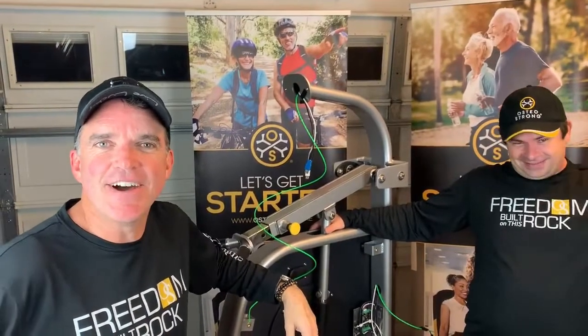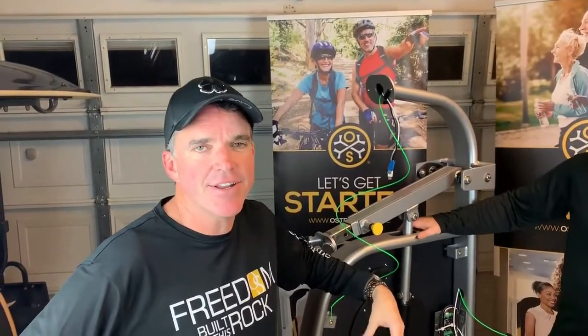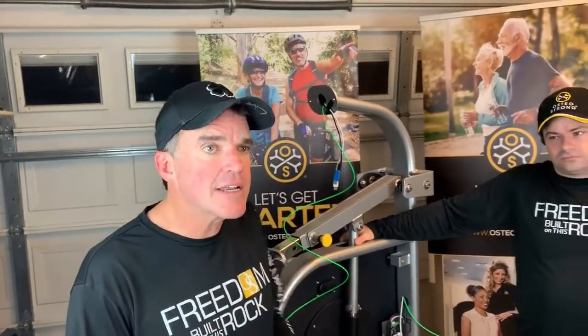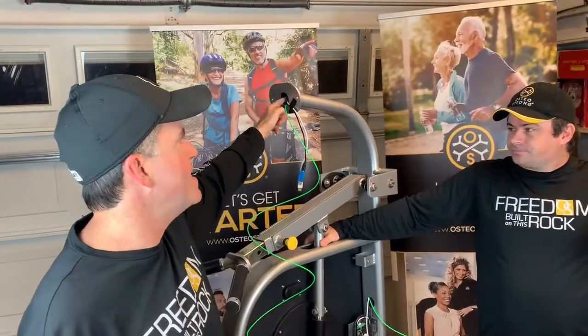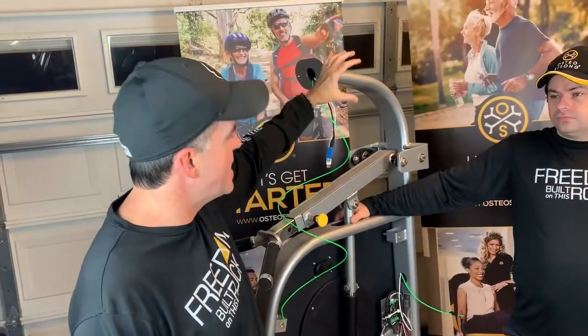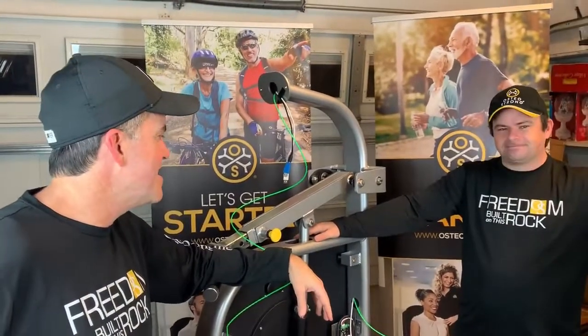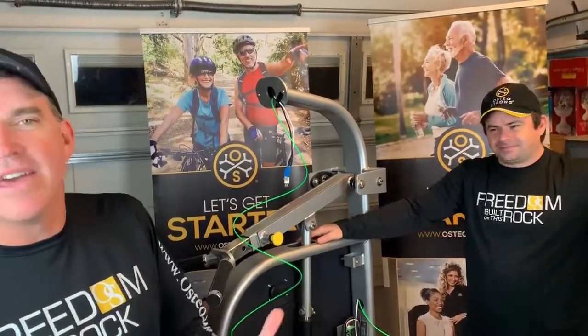Hi, this is Matt and Reed with another Spectrum troubleshooting tip. On a rare occasion, if you're having to do a tablet swap — as we covered in some of the other videos — you may accidentally lose track of the power cord for your tablet, which will slip down the neck of your core or postural GT down into the internal workings of your piece of Spectrum equipment, and you'll need to fish it out.